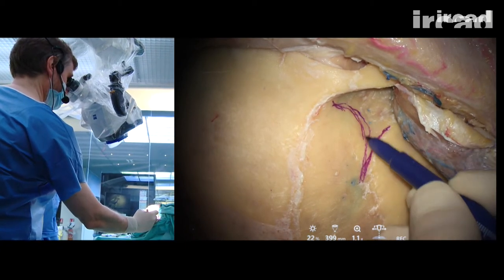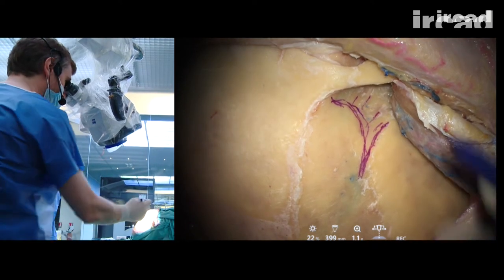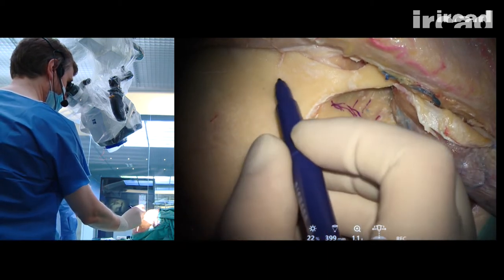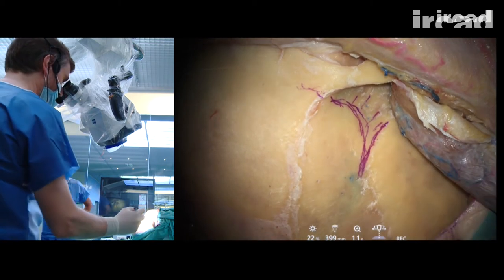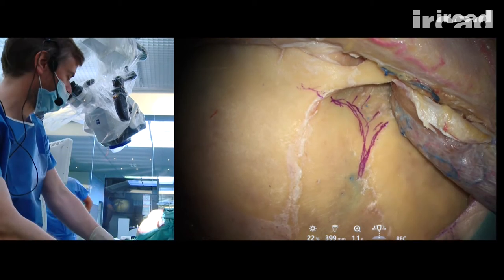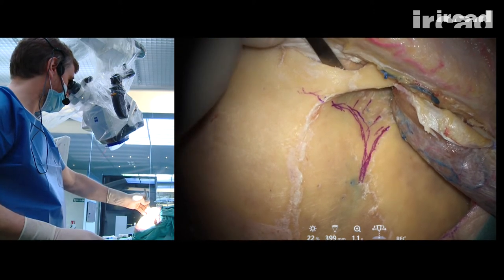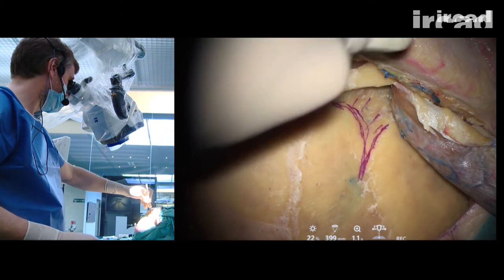And this will be the limit of the frontal lobe. I can see here some bulging of the bone. So this should be the limit of the frontal lobe and dura. So the best position for my McCarty keyhole, in order to find it here, I put a dissector into the orbit.